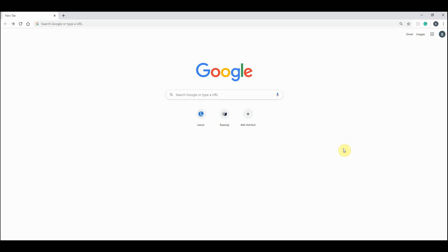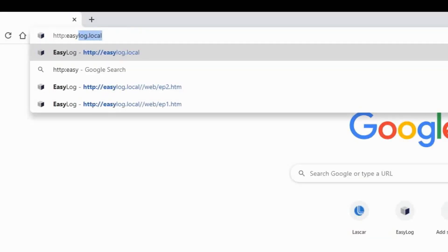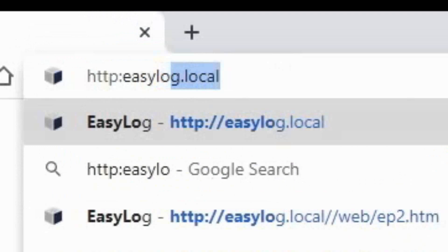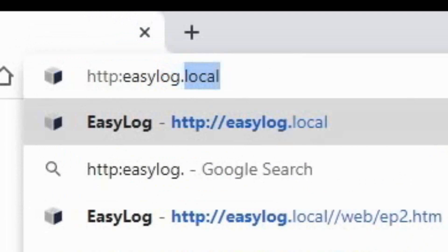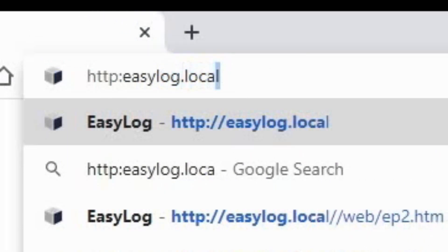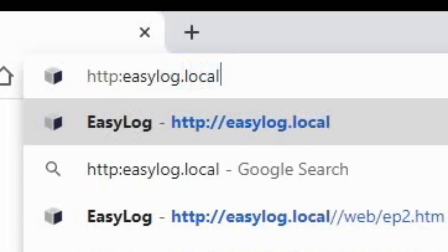To start with, we need to plug our LC into a PC using the USB cable provided. Open up a web browser and enter the following web address. The EasyLog home page will now load up.